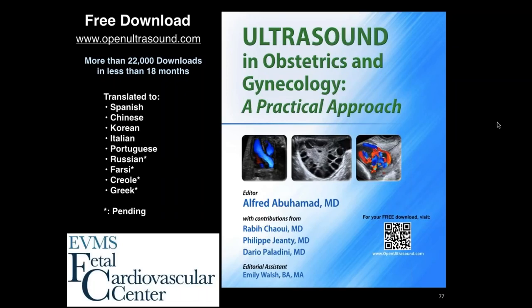We always ask the patient to wait for follow-up because first trimester cardiac imaging has not been performed for a long time. But there are several abnormalities that can be diagnosed in the first trimester and diagnosed really with consistency. So I would say it depends on your level of expertise, the quality of the ultrasound that you are doing, and the abnormality that you are detecting. Severe abnormalities that are clearly seen in the first trimester, I have no issues counseling the patients with regard to that.